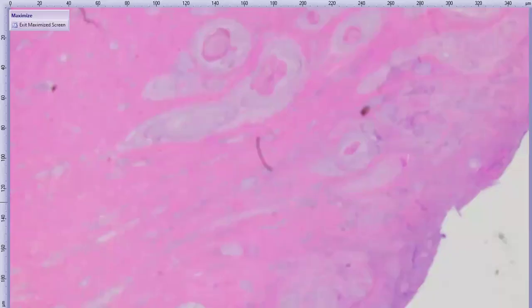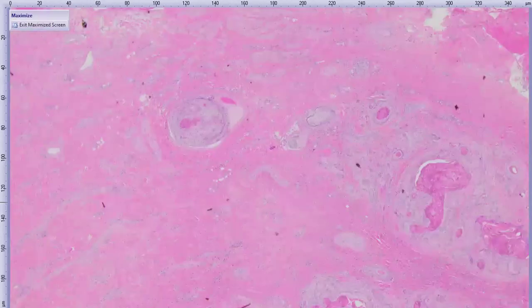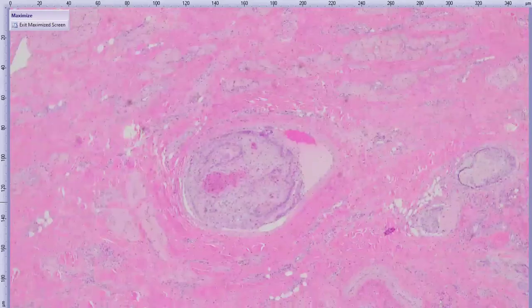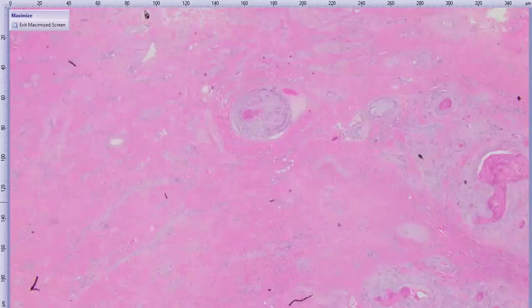Briefly, there's tumor already. Let me orient you though. Here's the haired skin. And here we are with neoplasm. Oh, here, for example, I don't even know why I put suspected if it's here. That's vascular invasion. This is the eyelid from the same eye. Oh, the same, okay. Yeah, that's vascular invasion. Anyway, it doesn't matter if it was anywhere else, it's there. Yeah, exactly. That's a good one.